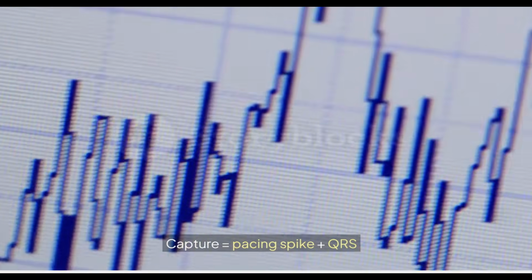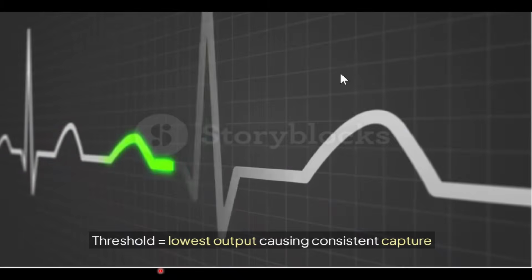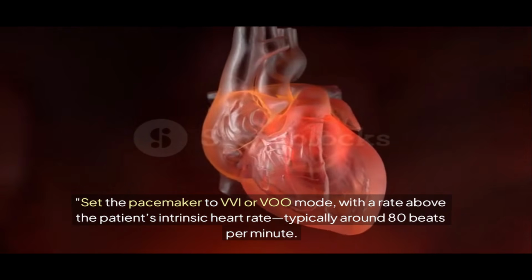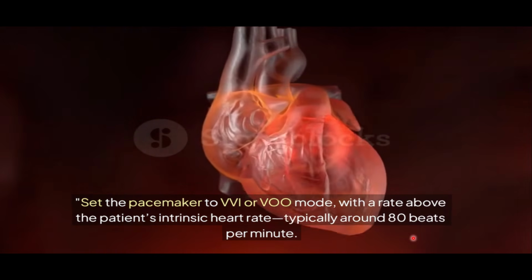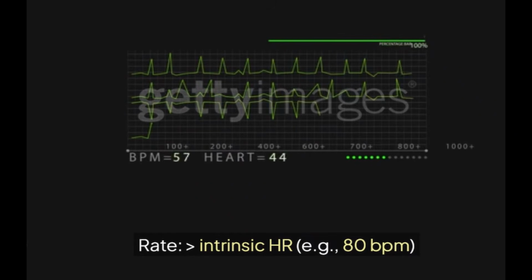Capture is equal to pacing plus QRS complex. What is capture threshold? It is the lowest output causing consistent capture. How to test the capture threshold? We should set the pacemaker to VVI or VOO mode with a rate above the patient's intrinsic heart rate, typically around 80 beats per minute. We should keep in mind that the rate of the pacemaker should be more than the intrinsic heart rate to test the capture threshold.